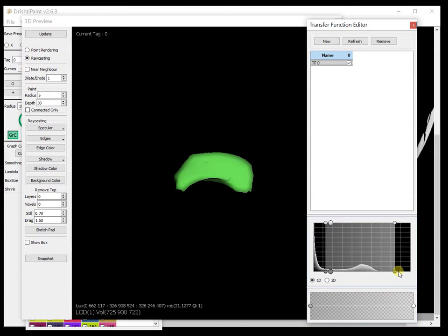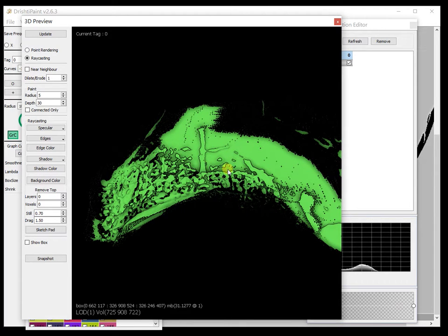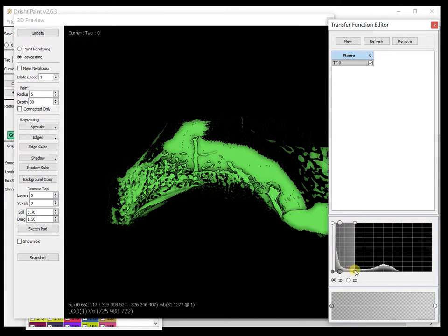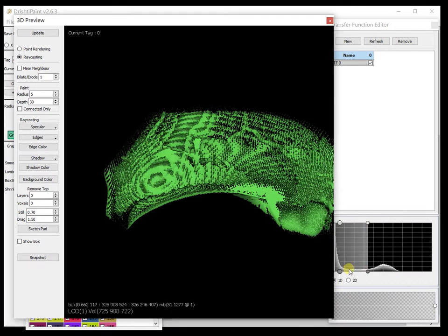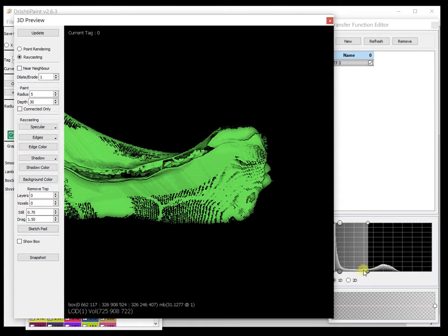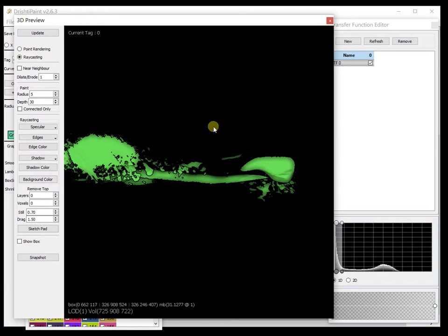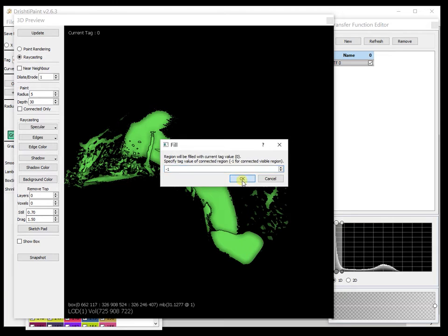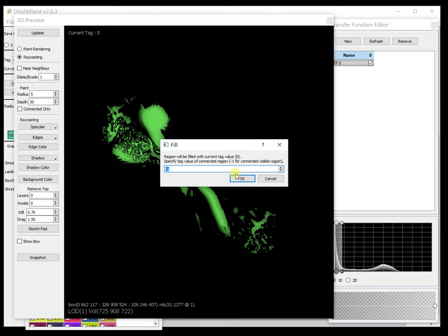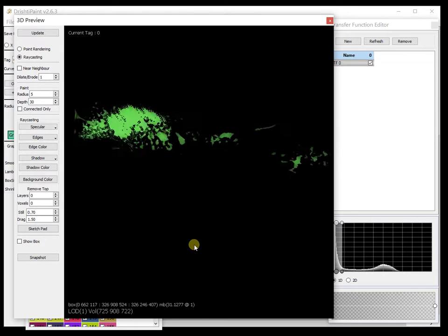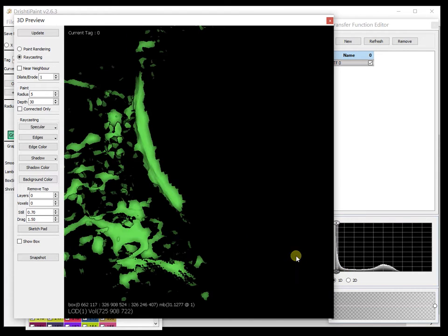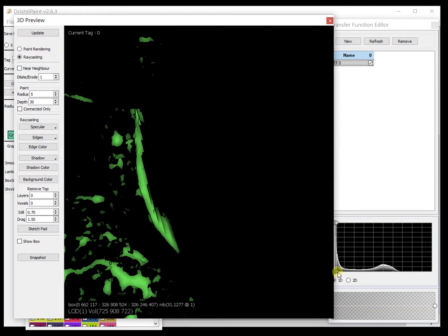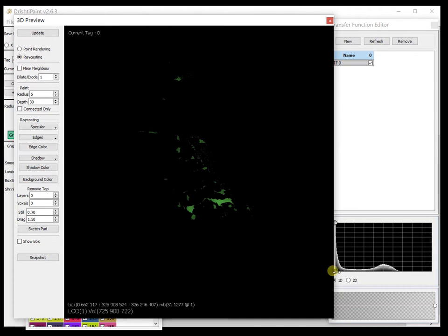So we want to isolate the pores. Let's give it a different tag. First let us remove these pieces that are connected to the bone. So let's isolate these pieces. Currently we are tag zero. Let's press F to just fill that and remove those isolated pieces. So hover over the piece that you don't want and press F. It will basically just remove that connected piece.